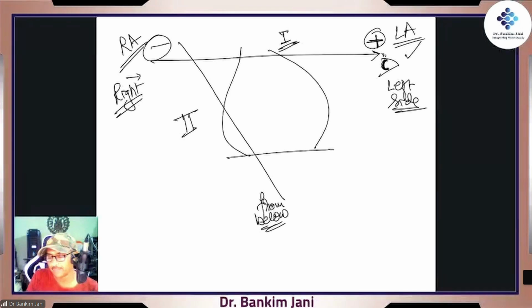All right, let's settle it. This is lead 2. In lead 2, this is minus, this is plus. As soon as this is plus, we are watching from below. Simple. We are watching from below, not from the right, because this is negative.